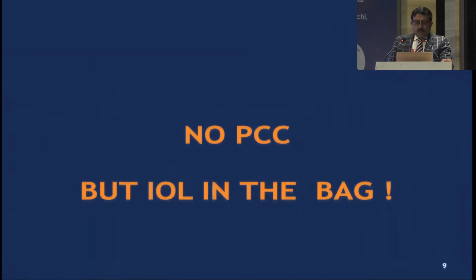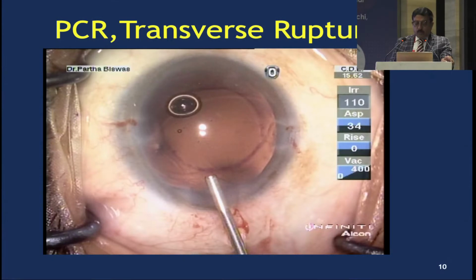So I'll go on to the last two videos of mine, and they are going to be similar to what Dr. Prakash has shown, but I'm going to show you just one or two small tricks. With this amount of thought, if it can be done well, if you think your expertise is good enough, please do it. But if you think that you're coming too close to the waterfall and things are not going well, just take the lens out and put a 3-piece lens.